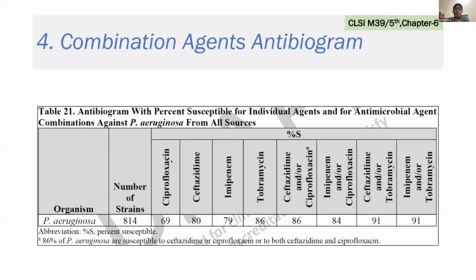One more thing you should keep in mind is, just because you are giving an antibiogram like this, it does not mean that you are confident on whether it is synergistic or antagonistic. That we are not committing to. It is only to help the clinician understand what is the impact if they give these two drugs together.